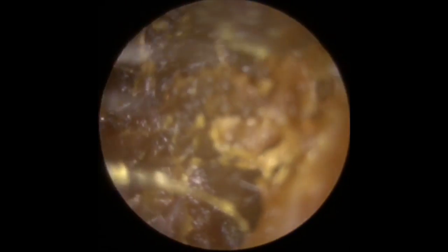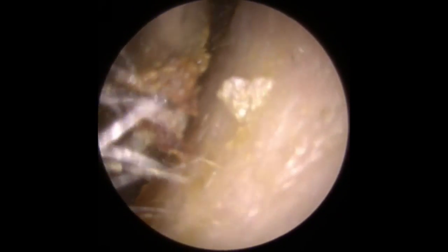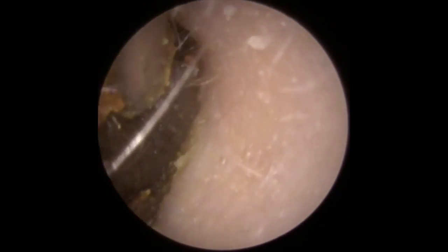You can just see it's starting to hold together a little bit more solidly. So we're getting to the slightly older, a little bit more dried up wax. You can normally tell when it gets to this really sticky dried up wax — it gets much darker in colour quite quickly. So we go from that lighter brown colour here, and then you can see the softer lighter brown stuff at the bottom, and then you'll start to see a much darker colour come through there. That's when you know you've hit this kind of much more sticky wax — it goes a very dark brown, almost black in colour.